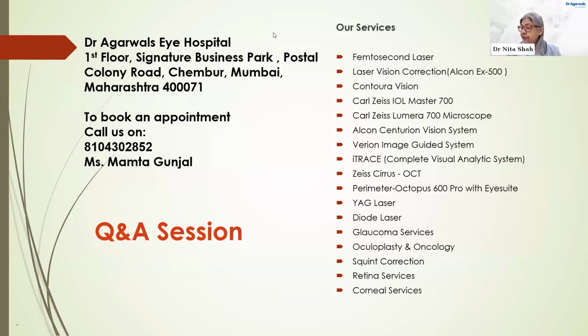So as I said earlier, when we started doing LASIK from around the year 2000, we used to tell people that you may find a little difficulty at night. And we used to tell that to everybody. Now, we rarely have to say this. Prior to surgery, we have some markers which tell us who will get it, like people who have large pupils, where it dilates at night. And generally, when we pointedly ask them prior to surgery, do you have a problem driving at night? Most of them already have it because their pupils are shaped like that. It is not just because of the laser surgery. This was an issue with the earlier technology used with laser surgery.